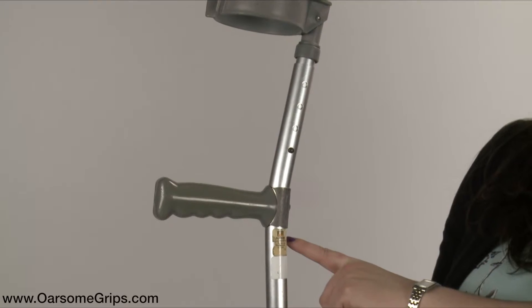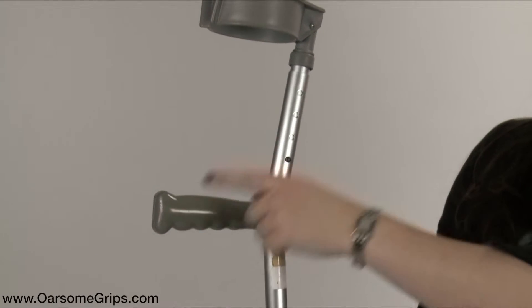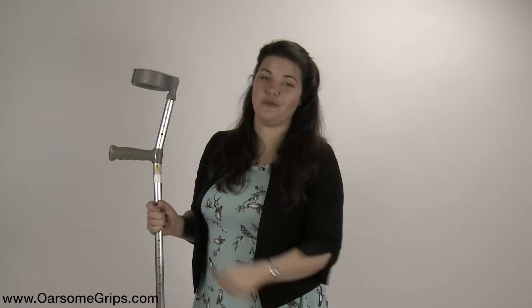To identify the type of crutch that you have, look for the label behind the crutch handle, on the crutch handle itself, or on the elbow cuff. On one of those three, you will be able to find the make or model of crutch that you have.